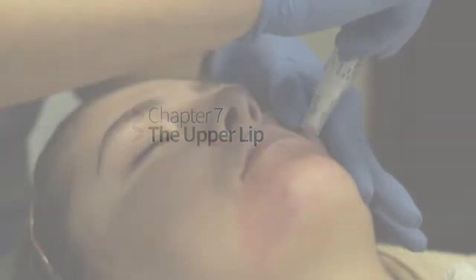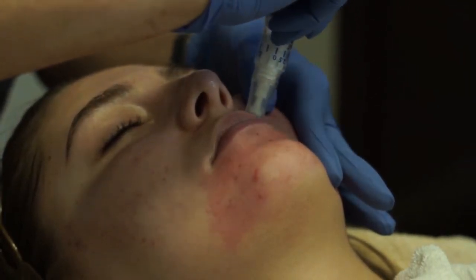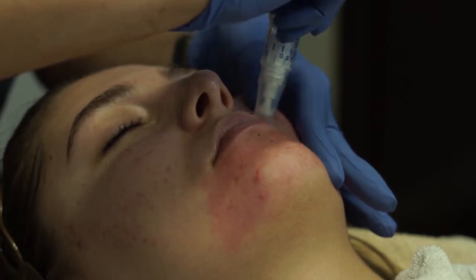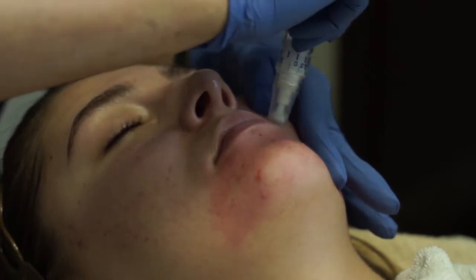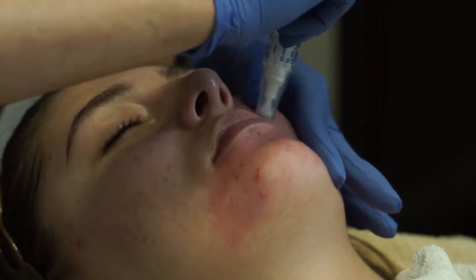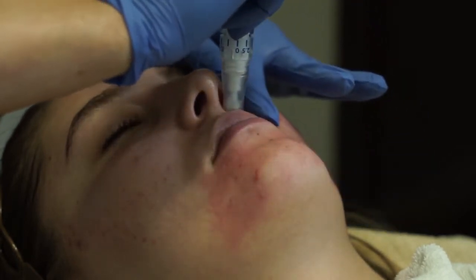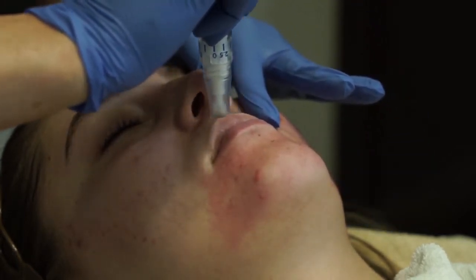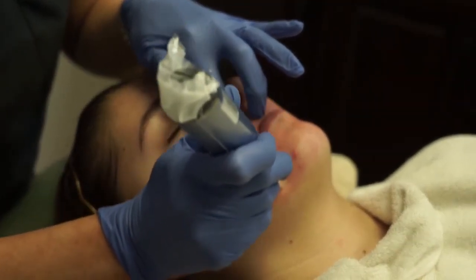The upper lip. As you move to each new section of the face, get comfortable. It may be necessary to move the position of your body and hands in order to improve visibility, increase your comfort or grip, and keep the tip of the cartridge flush with the skin, especially when going over curvy, bony structures like the chin or nose. You always want to be in a position where you can comfortably hold the patient's skin taut and visibly see the amount of redness after each pass.